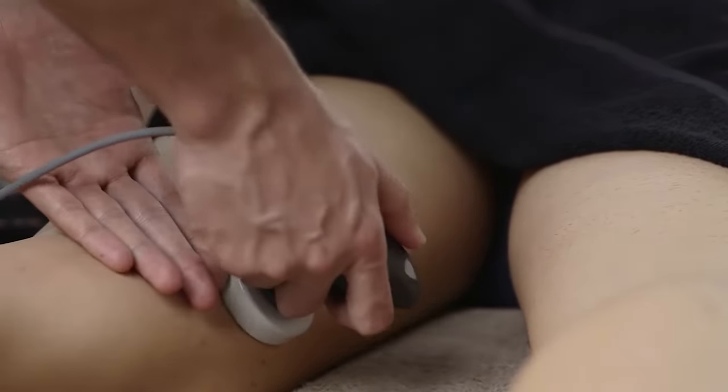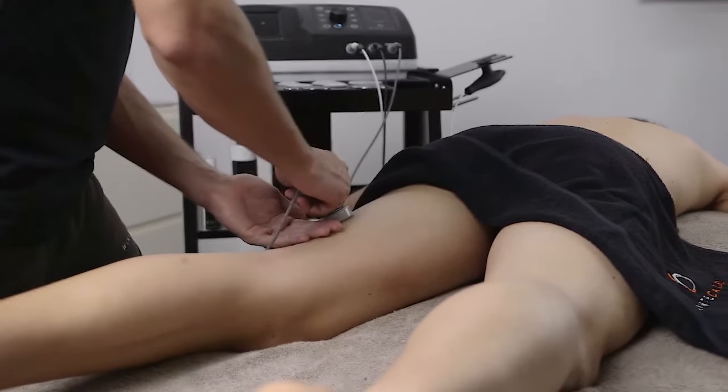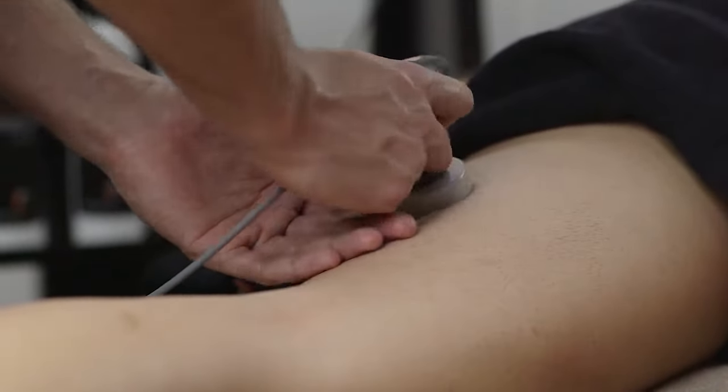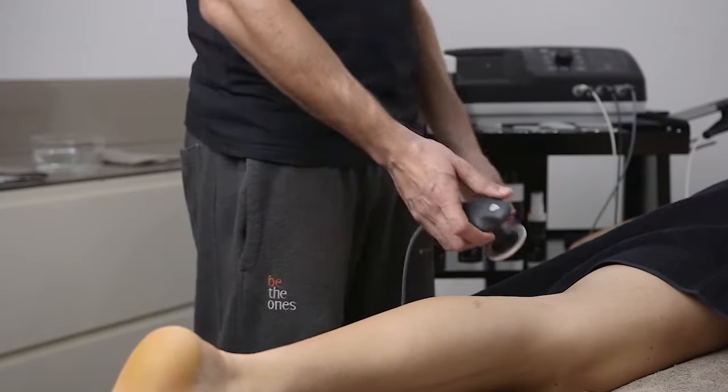T Plus also responds positively to regenerative and proliferative stimuli attributable to the application of electromagnetic fields around 0.5 MHz to the body tissues.